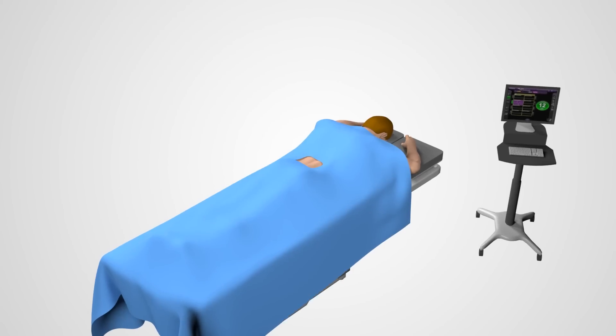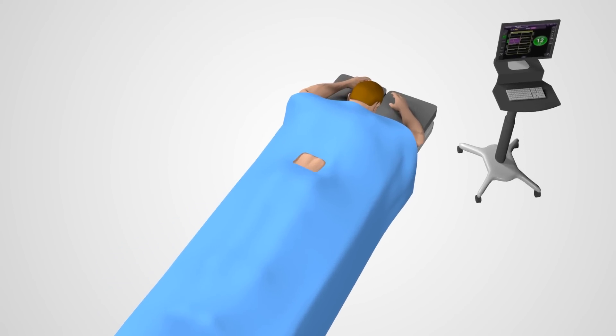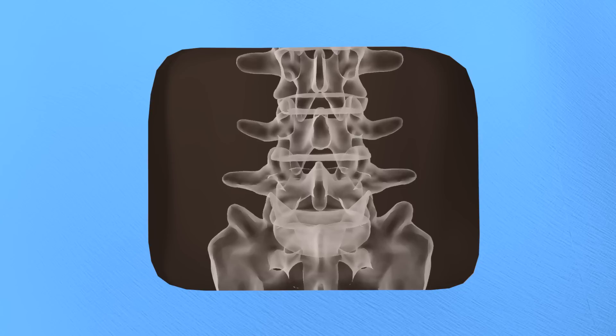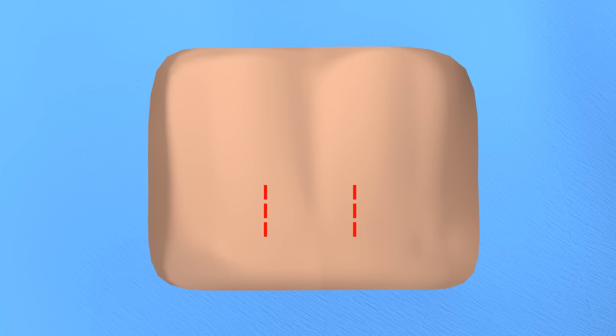When undergoing an MAS T-LIF procedure, you will be positioned on your stomach on the surgical table surrounded by the appropriate surgical draping. An X-ray of your spine will be taken to show the appropriate disc space. Your surgeon will make a small incision off the midline of your lower back or lumbar spine.